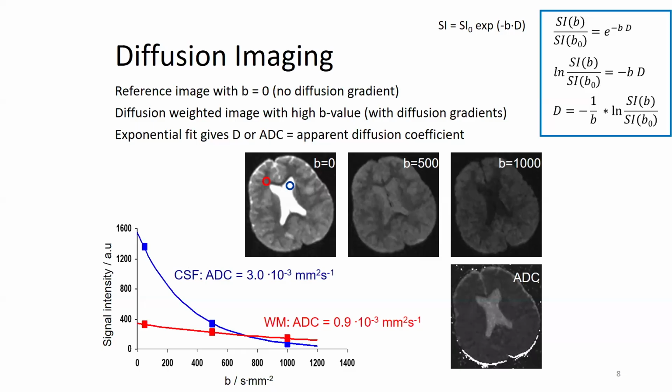And it's easier for radiologists to look at images, because every voxel here corresponds to the same voxel here.